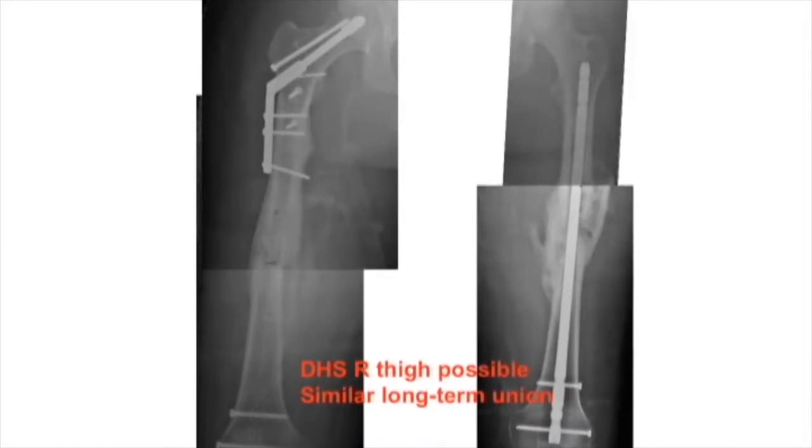Okay, so you could probably argue and say, well, what's the difference then? Why should I use carbon fiber over metal if they're going to be the same in 1 year? Well, for a nail, where it's a load sharing device, it probably is going to be the same long term, but in the short term, if you have more callus formation robustly at the early stages of healing and you can initiate weight bearing a lot sooner, there's where your reported benefit's going to be.